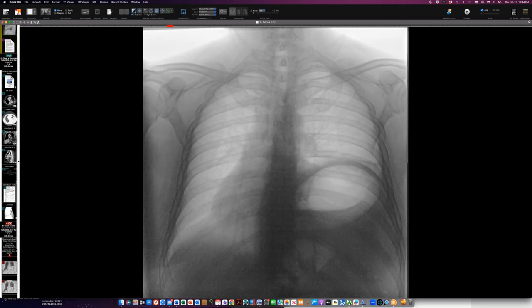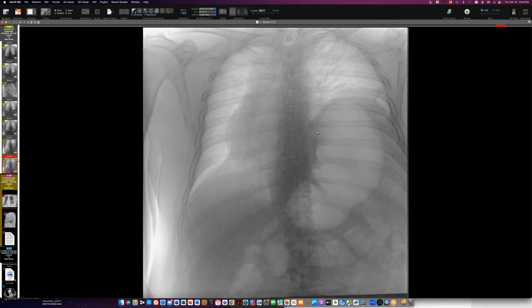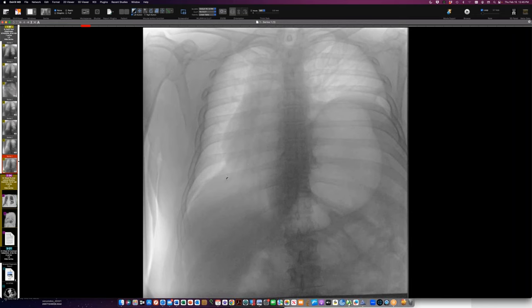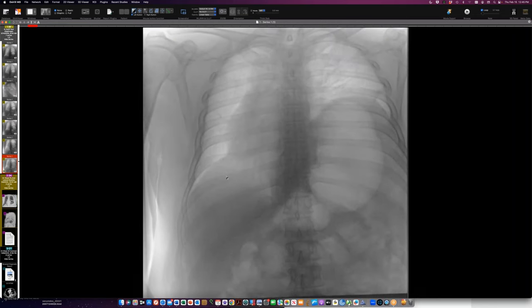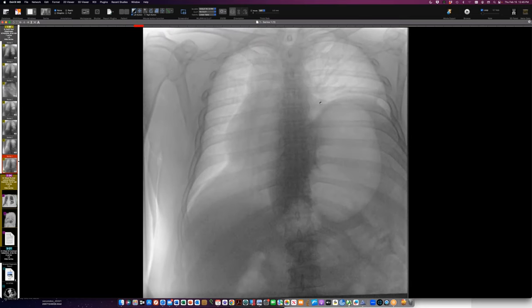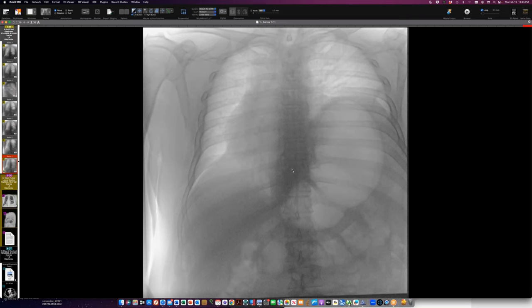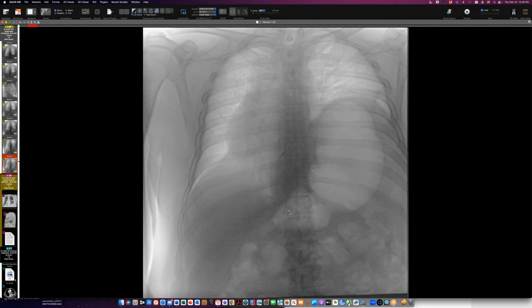The best part of the sniff test is to put the person supine, because sniffing is a stress test for the diaphragm. This is the same person now supine — if they still have some motion when supine, it's not completely paralyzed. Supine, we get very good motion on the right and some motion on the left, just a little bit — so there is still some strength on that side. I concluded the left hemidiaphragm was severely weakened but probably not completely paralyzed.